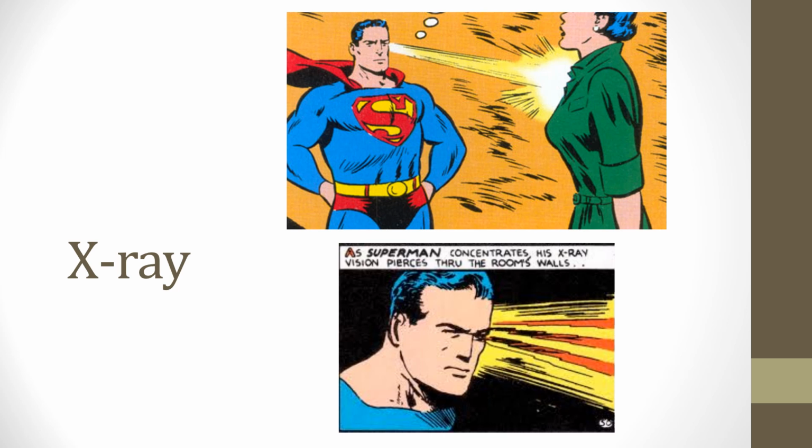So we'll pretty much focus on chest X-rays overall for this presentation. I do have another chest X-ray YouTube video that I will try to link in your resources as well, that goes over my personal technique and different ways to read through the X-rays. I strongly recommend that one if you haven't looked at it before. It's called Chest X-ray Evaluation, so that's something to look at.